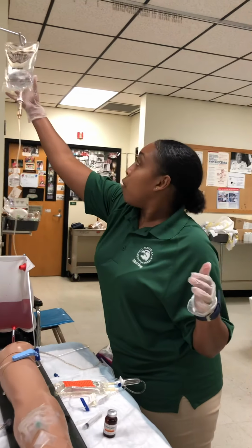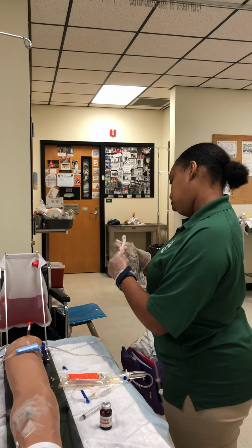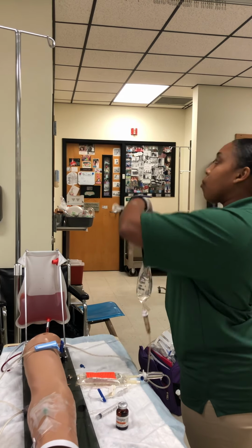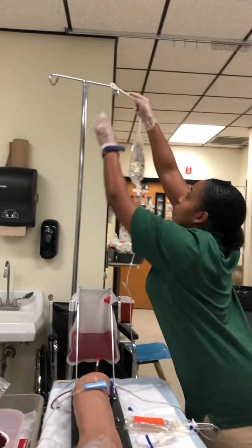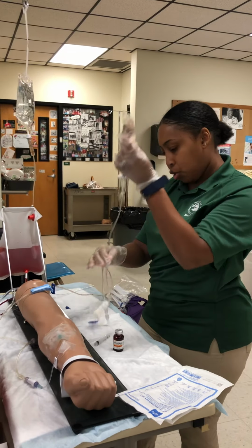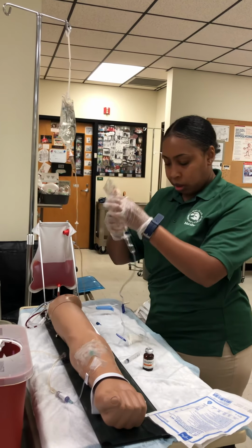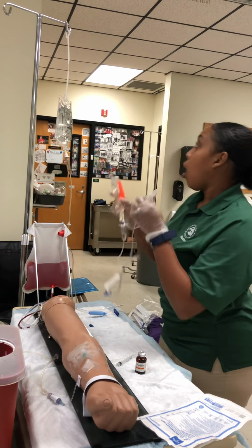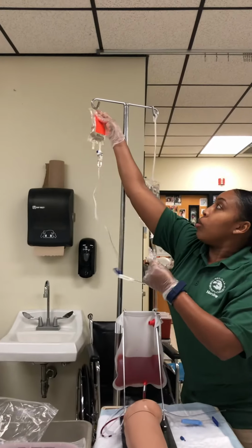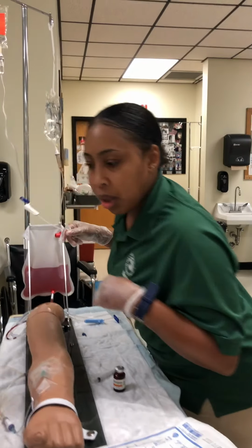We're going to lower our primary fluids. Okay. And we're going to make sure that this is clamped off. And I'm gonna hang this up here. Okay. Find some alcohol.